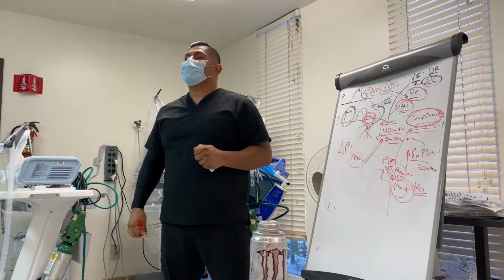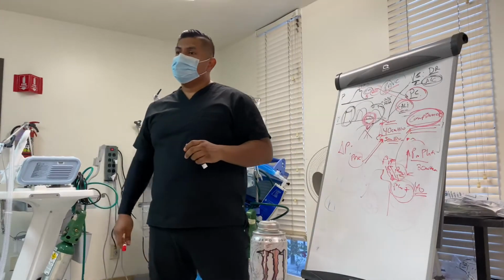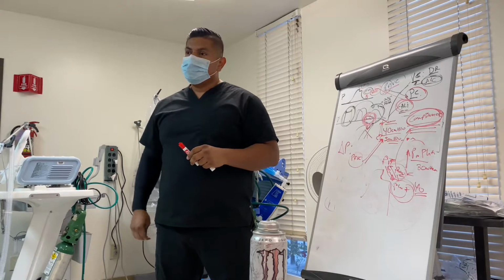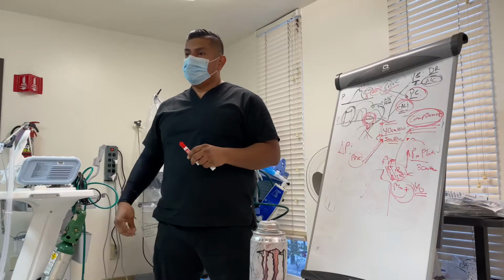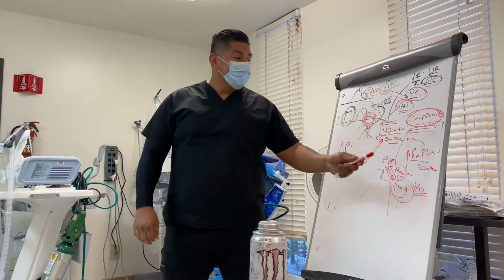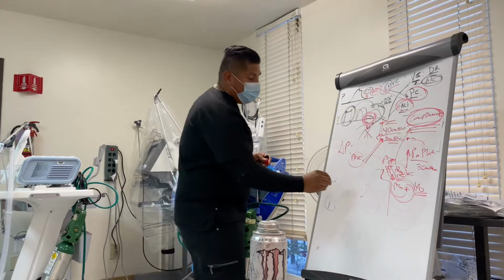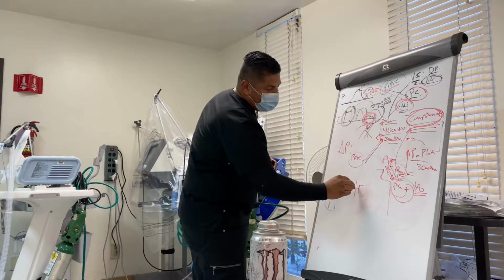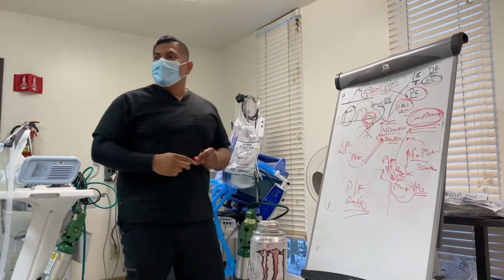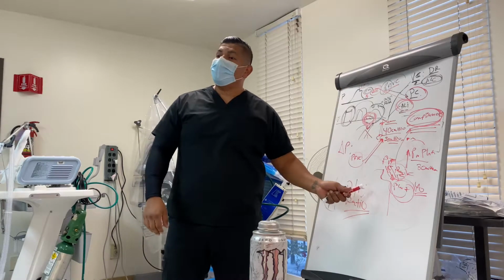That is ventilation. Correct. And as a therapist, we would base our recommendation to the doc to go into PC ventilation on our compliance, plateau pressure, and if you're looking at blood gases, there's something that we call the PF ratio. The PF ratio lets us know what our PaO2 is versus our FiO2.